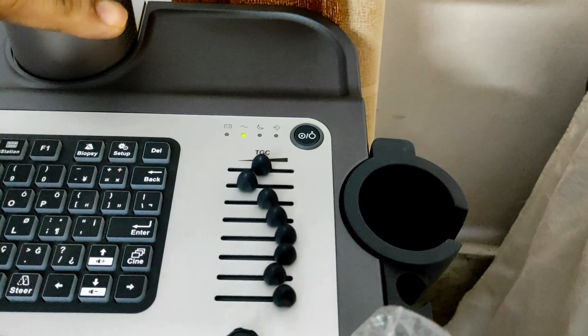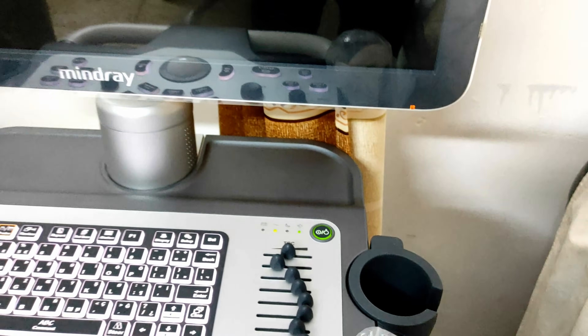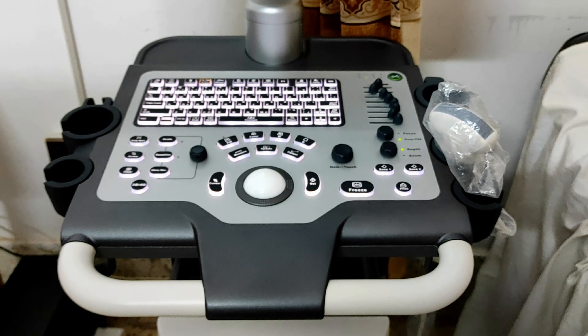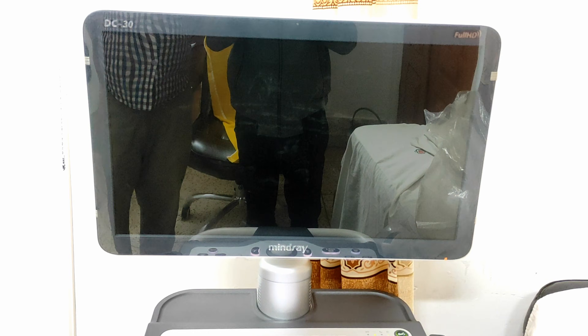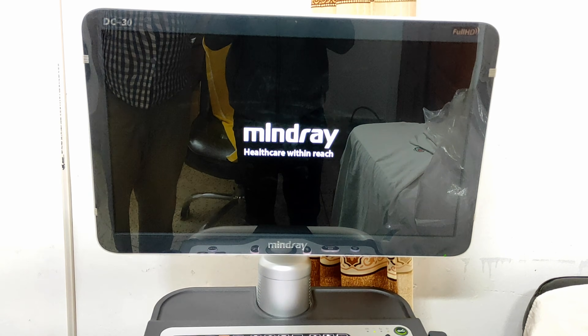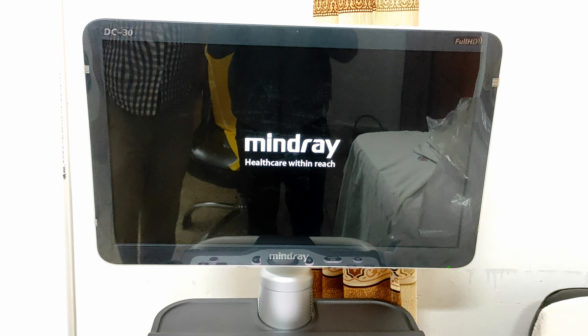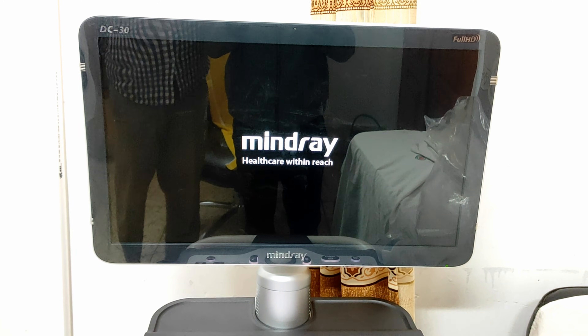Now click on the device power button. Your keyboard light will turn on, which means your machine is initializing. Notice on the screen — your machine is going to be ready and turn on.